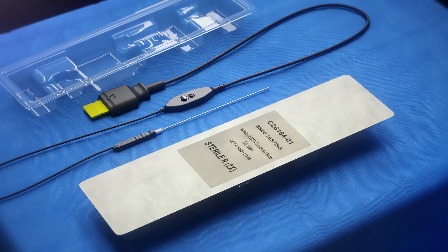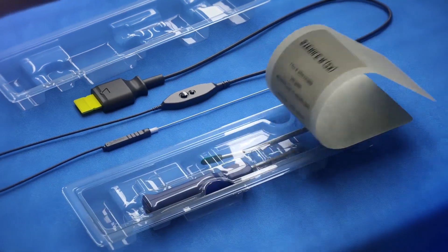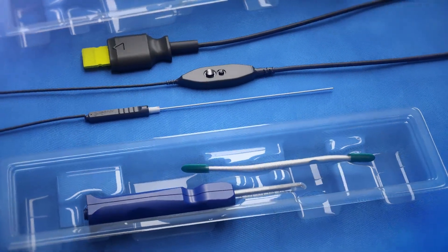The Nanoscope release system is packaged as a fully sterile kit that includes a nano needle, the centerline device, and a single-use dilator and synovial elevator instrument.